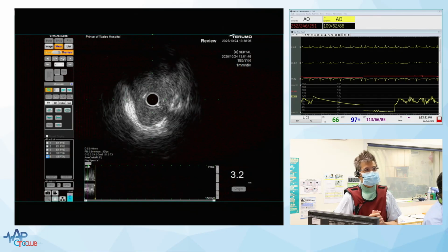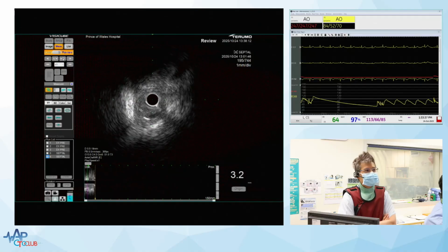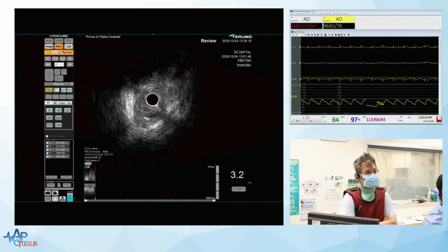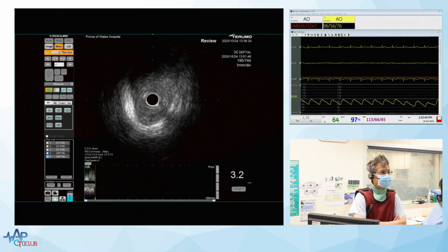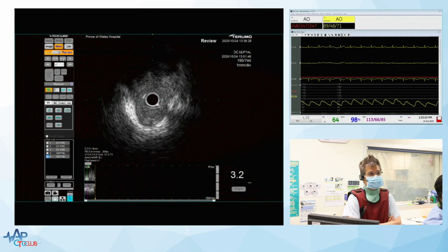And how many would just use traditional wiring? If you made progress, punctured the proximal cap, would you use 3D wiring to try and get true crossing? Okay, thank you. If I can penetrate this LAD CTO proximal cap, and after that, do I do the 3D wiring technique or retrograde?